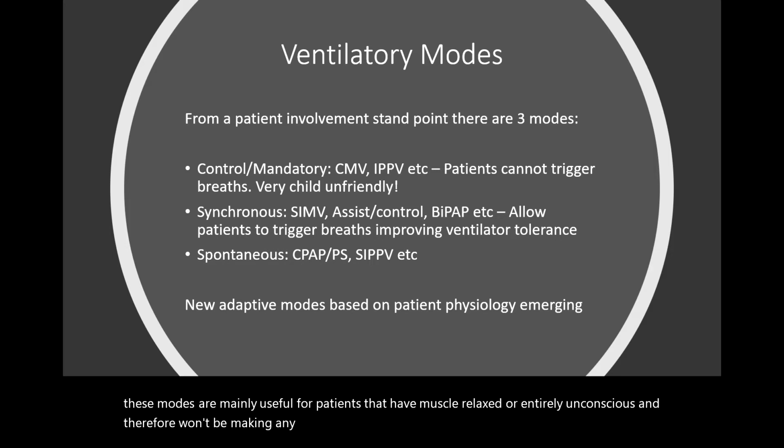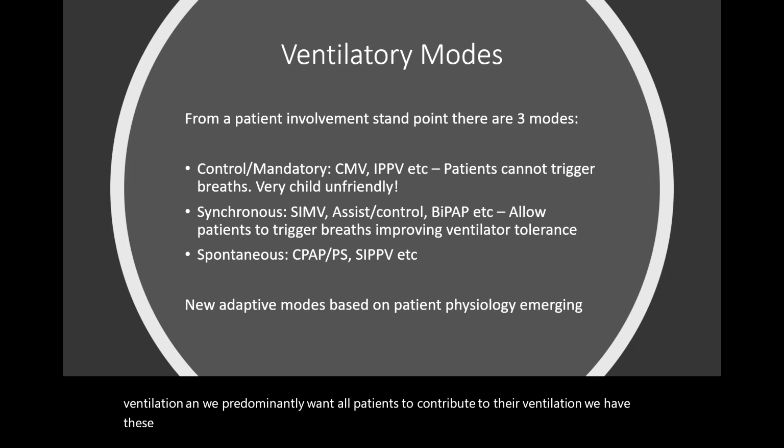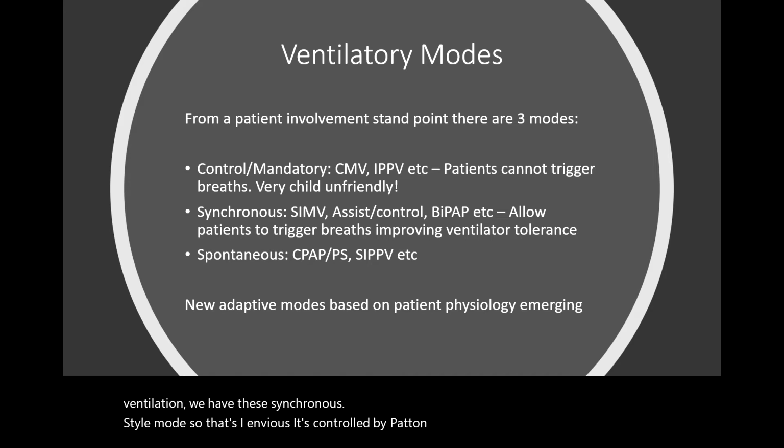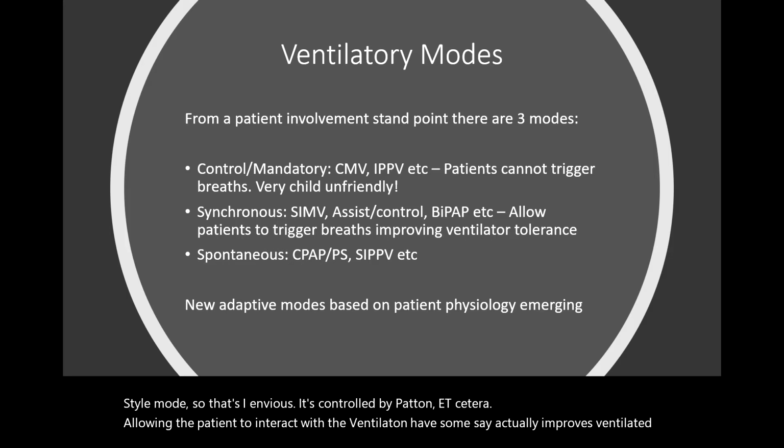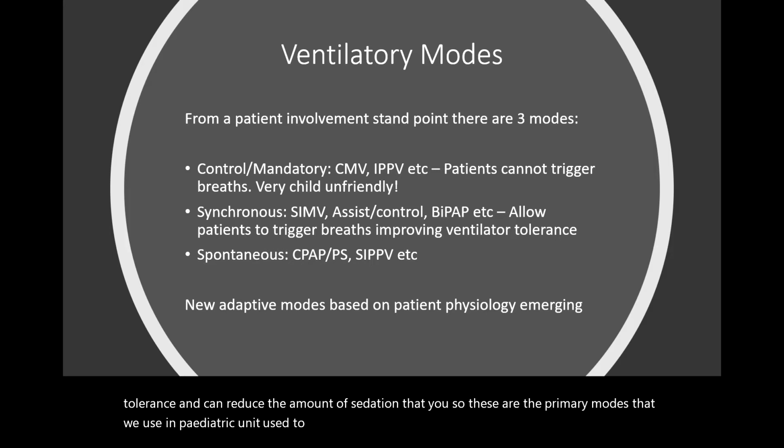For patients that want to contribute to their ventilation, and we predominantly want all patients to contribute to their ventilation, we have these synchronous style modes, so SIMV, assist control, BiPAP, and etc. And allowing the patient to interact with the ventilator and have some say actually improves ventilator tolerance and can reduce the amount of sedation that you need. So these are the primary modes that we use in pediatrics. We don't use the control mandatory modes at all, certainly not at King's.